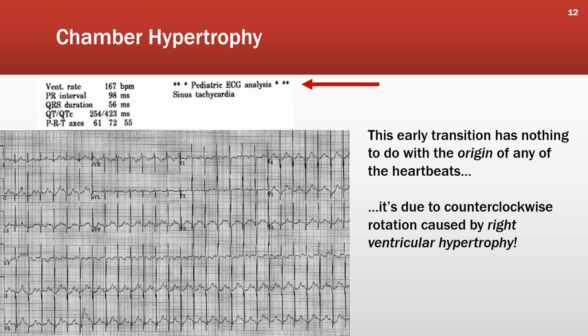And as you may have suspected, it's due to the fact that we have done an ECG on a small child.